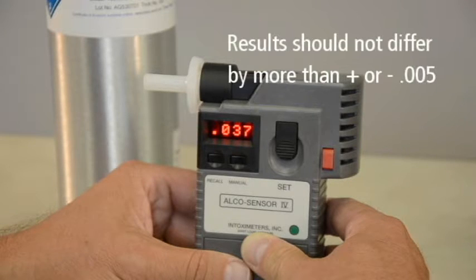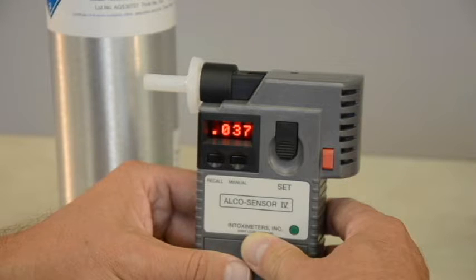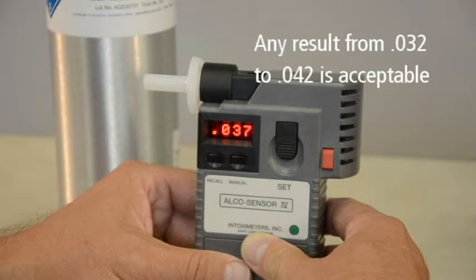Remember, the results of your accuracy check must be within plus or minus .005 of the expected known value. From our earlier example of an expected value of .037, any result from .032 to .042 is acceptable.